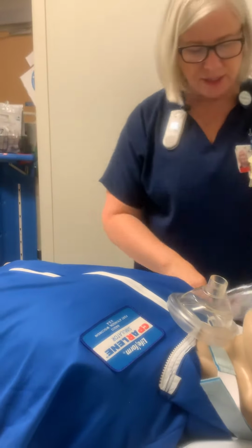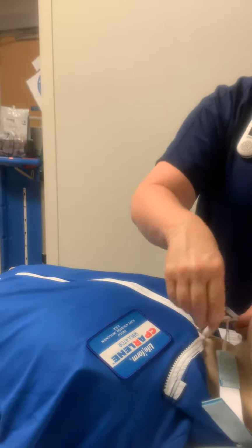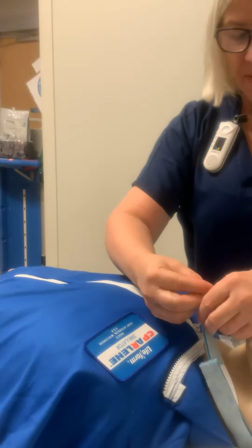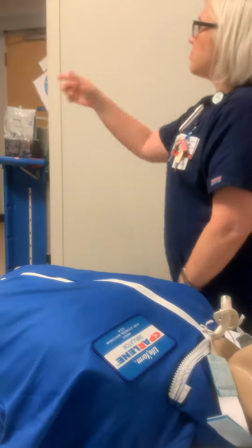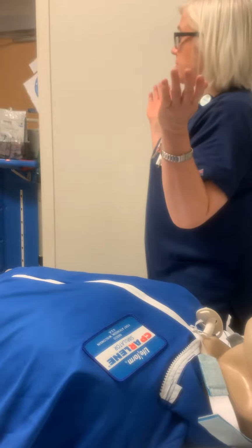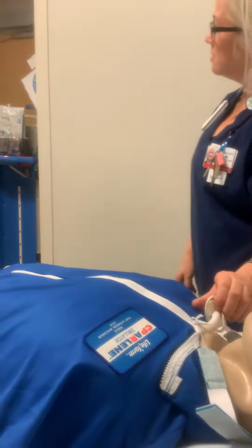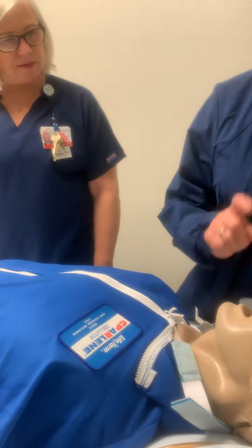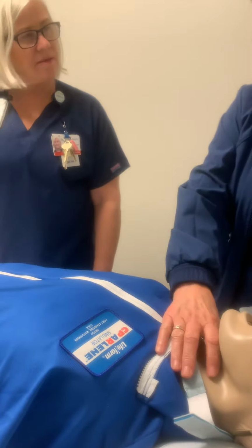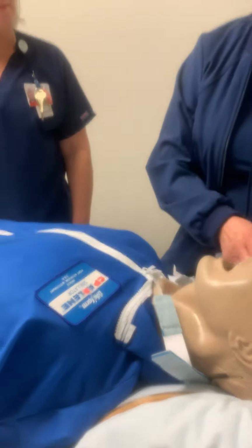I have another patient who has a tracheostomy, and the upper airway is intact, the larynx is intact. So my patient has just a tracheostomy, larynx is intact, it falls out. I need you to take care of this patient for me. Okay, I'm gonna call SWAT. I'm going to airway here, but I'm gonna cover this. Okay, what are you gonna cover it with? A gauze. Right. And then ventilate them.